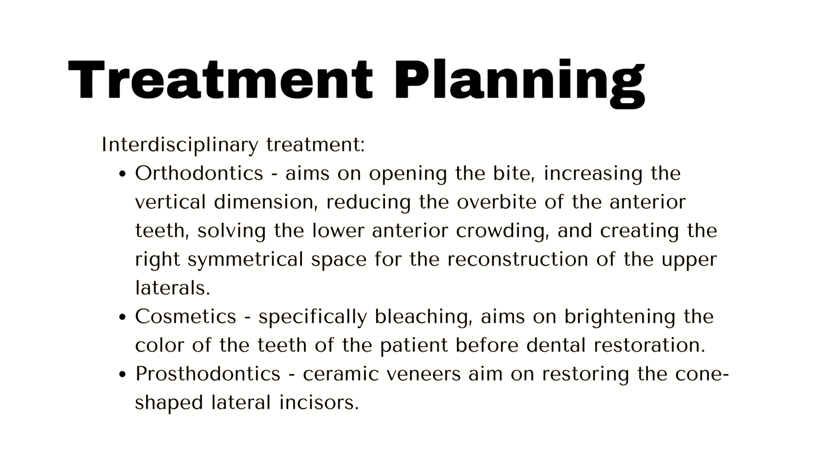Orthodontics aims at opening the bite, increasing the vertical dimension, reducing the overbite of the anterior teeth, solving the mandibular anterior crowding, and creating the right symmetrical space for the reconstruction of the maxillary lateral incisors. Cosmetics, specifically bleaching, aims at brightening the color of the patient's teeth before dental restoration. And prosthodontics, which is ceramic veneers, aims at restoring the cone-shaped lateral incisors.